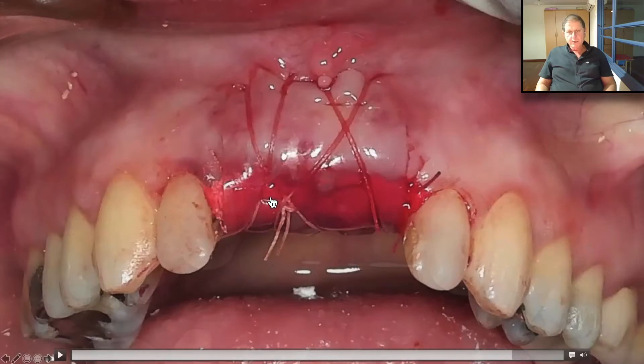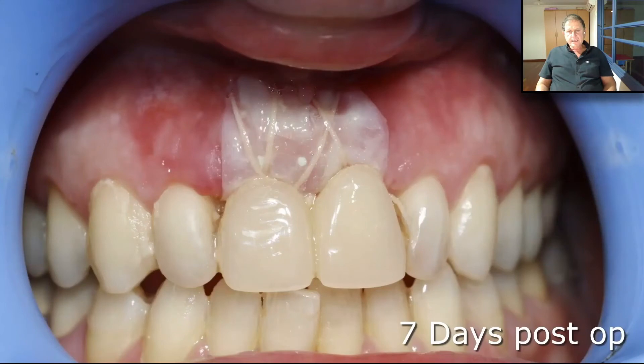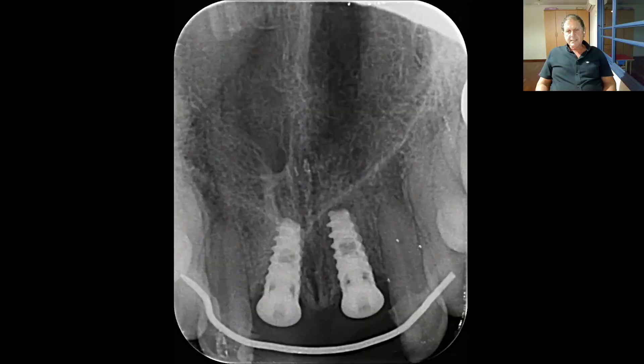Don't forget, everything here was open. That's how it looks seven days post-op. That's how it looked three months post-op — you can see the papilla is perfectly in place, and when we take down the narrow end, we can see everything is wonderful keratinized tissue.